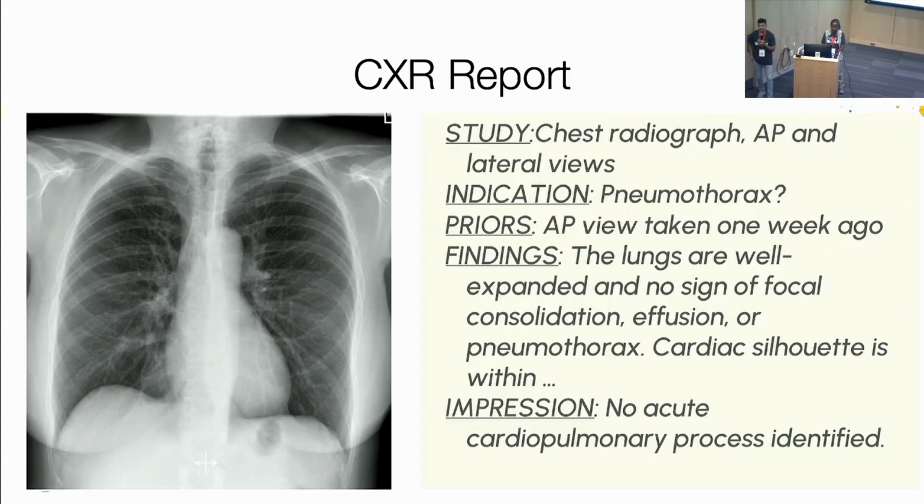Exactly. Great. So the answer was that the findings is the entire thought process representing the image, and the impression is the conclusion. So all of those are very good points. I think you guys hit the nail on the head. The way that I would describe it is that the findings section is, in theory, going to mention everything that's visible in the image, whereas the impression section is what is relevant for the referring clinician to know. So in this example, let's say this was an ICU film, and there's a chest tube, there's a big pneumonia, there are two bilateral pleural effusions, and this is the third chest x-ray they've received today.